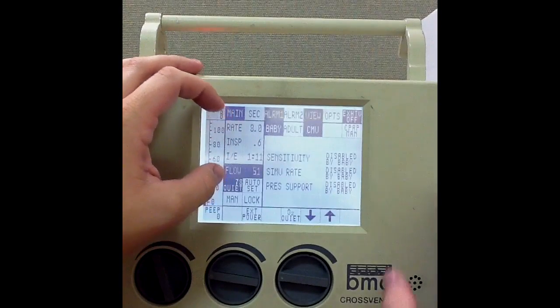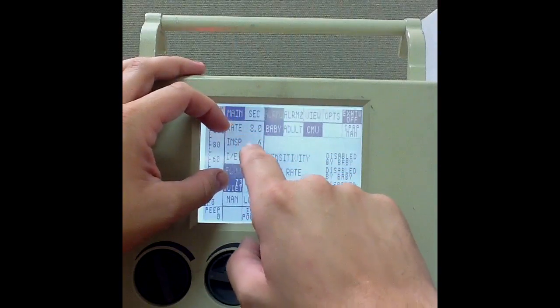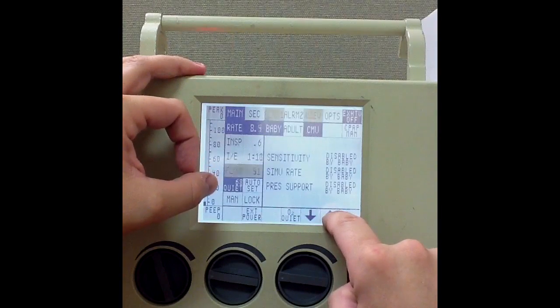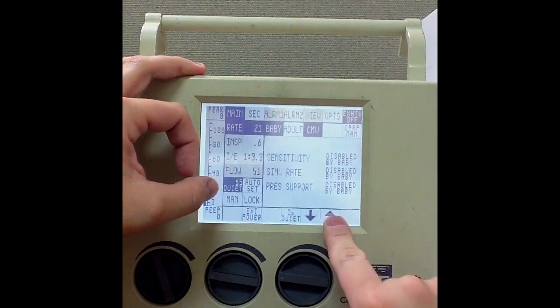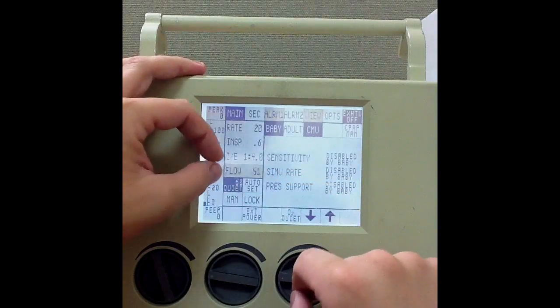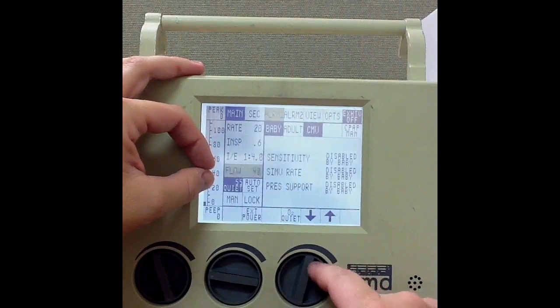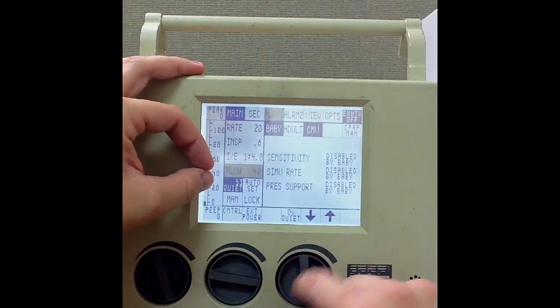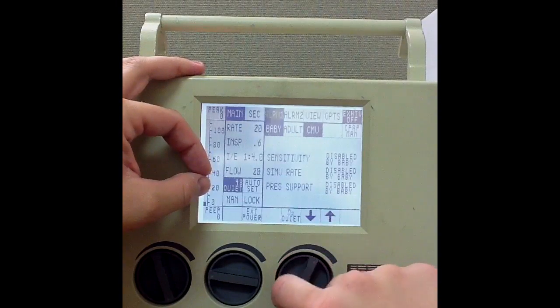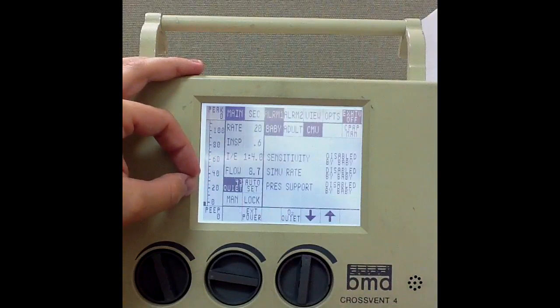Let's say we're doing a pediatric patient at 0.6 seconds — that's actually a pretty decent inspiratory time for a kid. We're going to want to go up on that rate, so let's make the rate 20. My flow is a little on the high side at 50, so we're going to drop that down a little bit — somewhere around 10 liters per minute. So 10 liters per minute of flow.